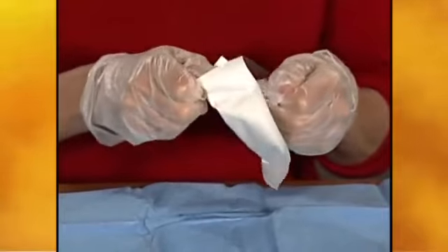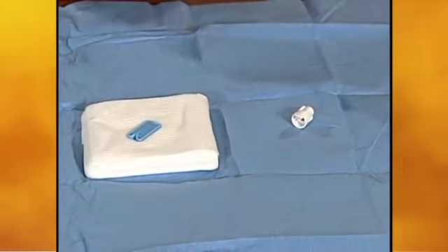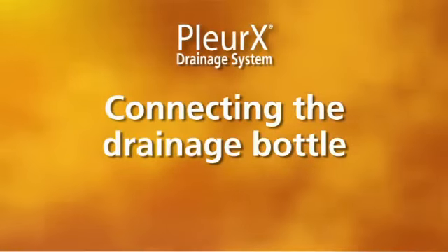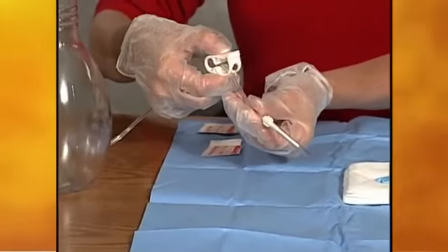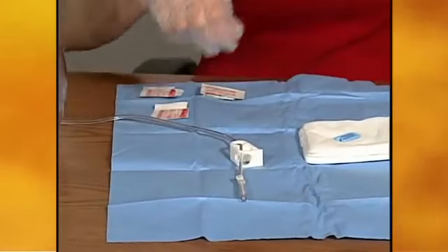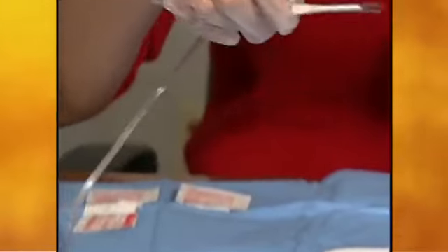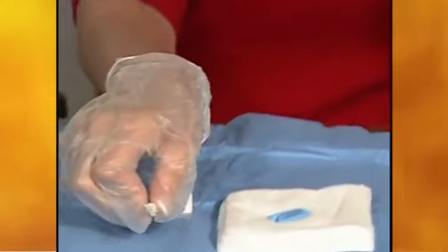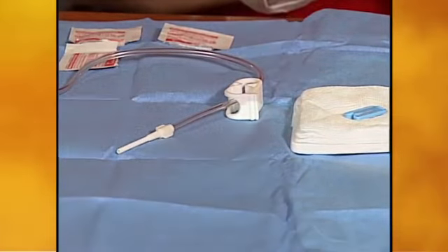Peel open the pouch with the valve cap and let the cap fall onto the blue wrapping. The cap will be used later. Tightly squeeze the white clamp on the drainage line so that it is completely closed. This clamp prevents the start of drainage until the patient is completely ready. Pick up the drainage line near the tip, twist the cover, and pull it off. The tip is sterile, so set the exposed tip on the blue wrapping near the sterile items.